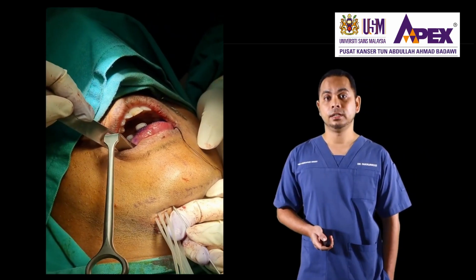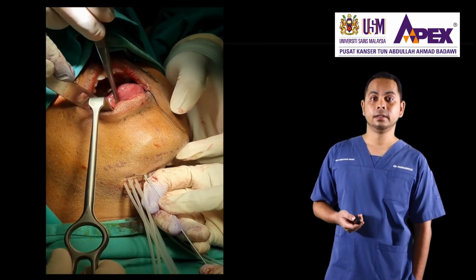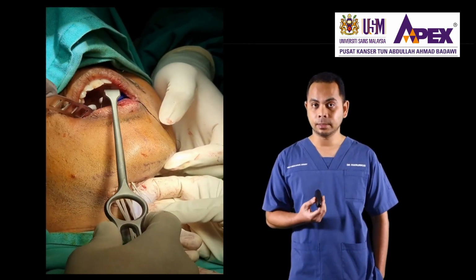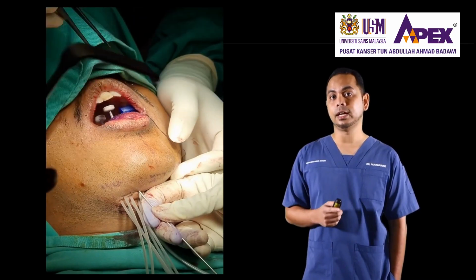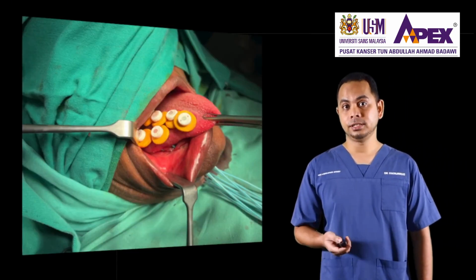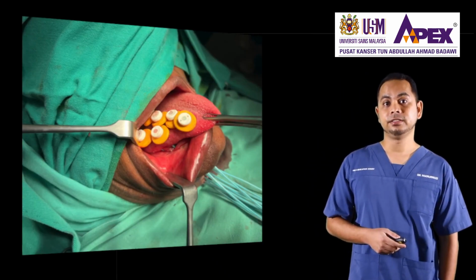So it is good if we can manufacture or invent equipment that incorporates probably a camera, an intraoral camera, and also a guide that can depress the tongue and guide us to put the applicator right where we want it.